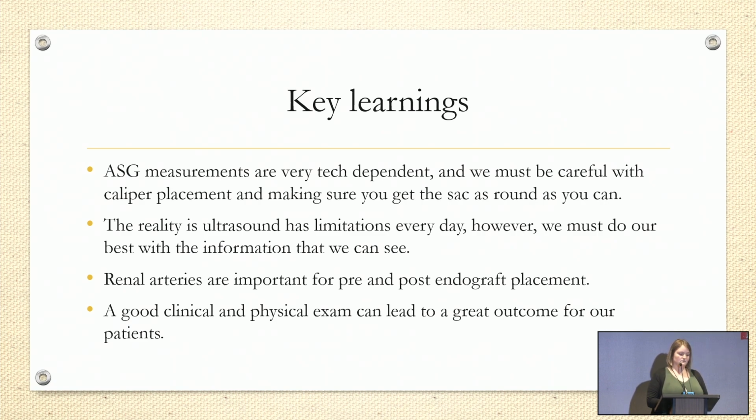The reality is ultrasound has limitations every day. However, we must do our best with the information that we can see. Renal arteries are also very important for pre and post endograft placement. And a good clinical and physical exam can lead to a great outcome for our patients. I really loved the fact that the patient came for carotid stenosis and we're fixing an aneurysm.